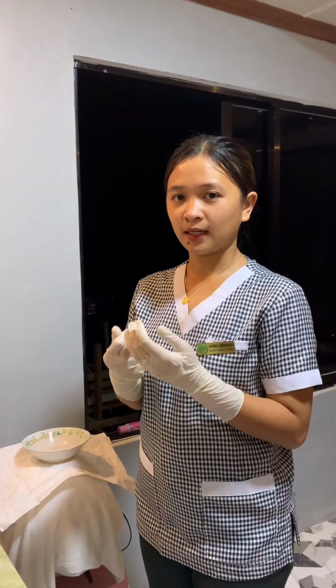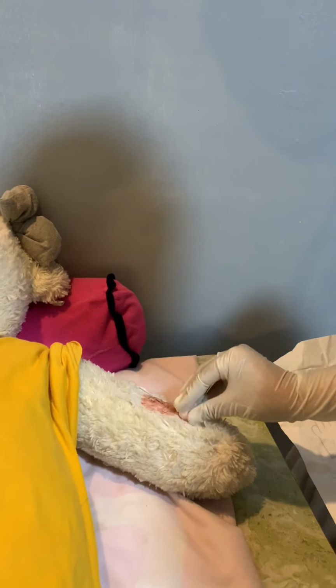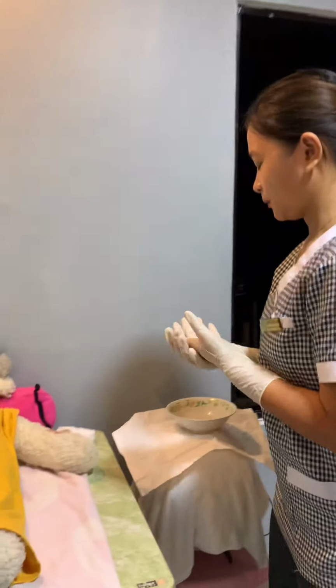I'm going to clean the wound with the antiseptic solution. I'm going to apply now the plaster and the dressing to my patient's wound.